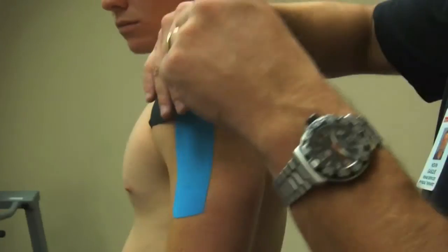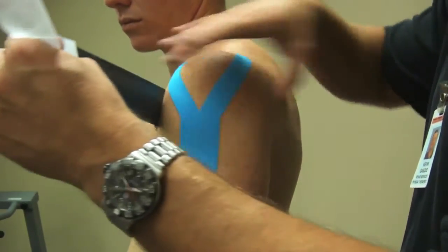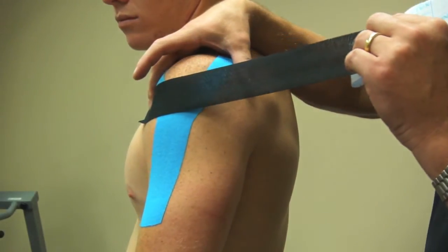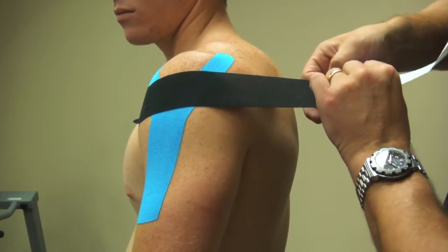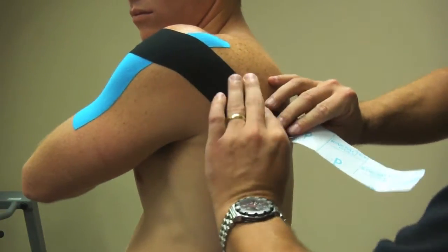A good one for a rotator cuff tendonitis and impingement is stabilization of the shoulder. Internally rotate their arm. Pull almost 50 to 75% on the tape, and then have them horizontally adduct their arm. So bring it across your body, and then just lay the tape fiber down.